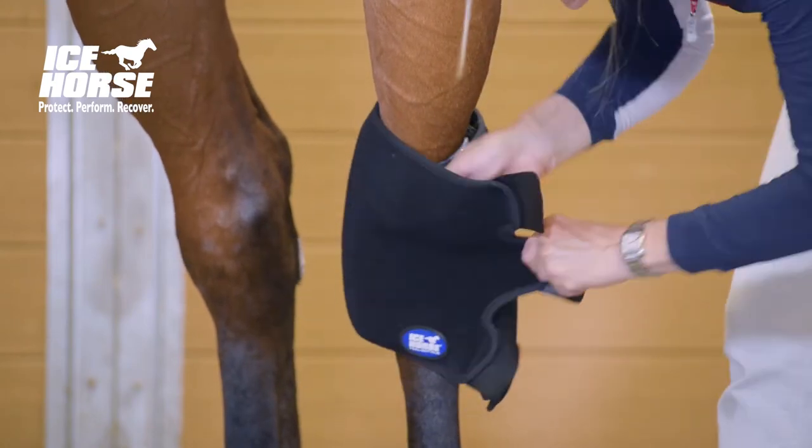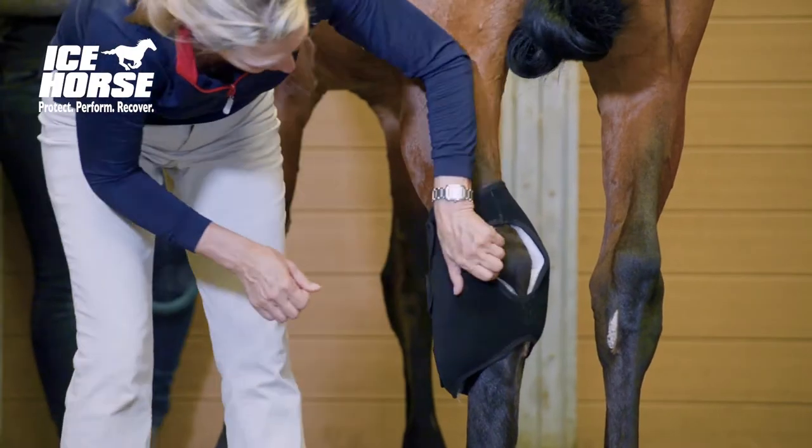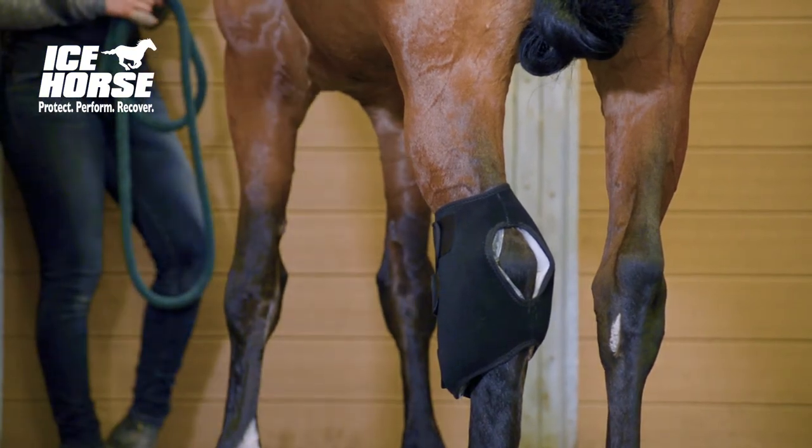Next, pull the outer sleeve tightly around the horse's hawk and fasten, starting with the middle, then the bottom, and ending with the top.